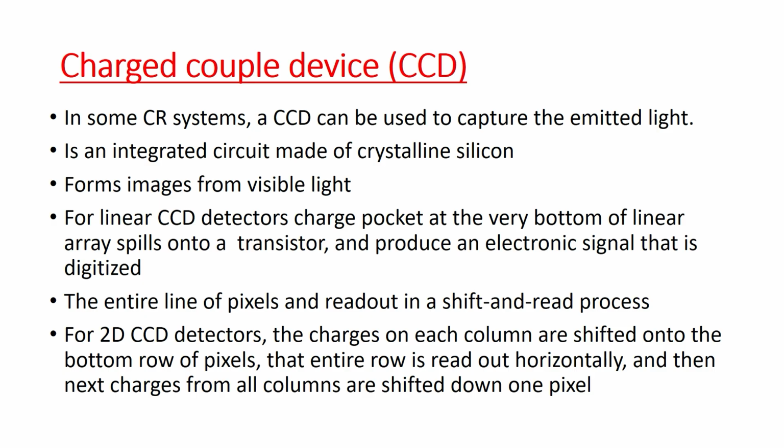The next topic is the charged coupled device, CCD. In some CR systems, a charged coupled device can be used to capture the emitted light. It is an integrated circuit made up of crystalline silicon. That means it forms the image from the visible light.